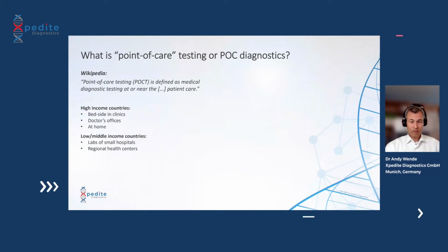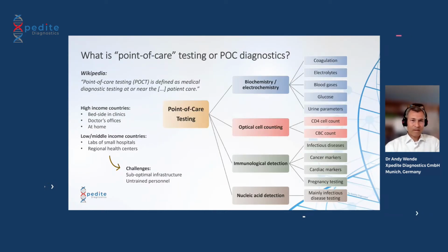In all these cases, you face some challenges because the infrastructure is not optimal for performing nucleic acid testing. And usually you have untrained personnel or even normal people like you and me, or maybe not you and me, but other people who are not involved in molecular biology, they have no idea how to extract a sample or to perform a diagnostic test. So these are the challenges you face in point-of-care testing in general. Now, it's also interesting to see that point-of-care testing is much, much more than just the nucleic acid-based detection methods that most of you might have in mind.